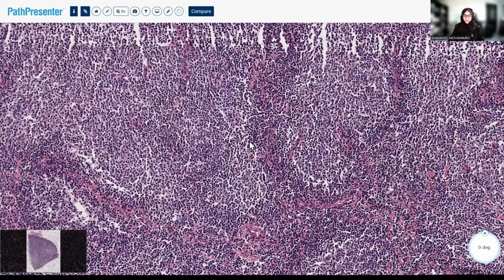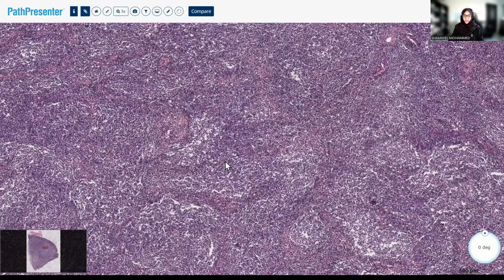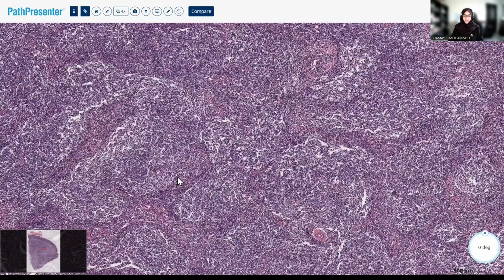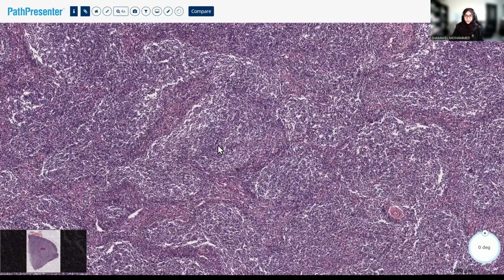One of the issues that we need to consider here is whether these nodular or round or follicular structures that we see are normal germinal centers or are they atypical proliferation, atypical follicles, or neoplastic follicles? If we compare it to the germinal centers that I showed you in our lymph node histology episode, they certainly don't have a reactive germinal center in the middle. They don't have a mantle. There's no polarization. And all you can see is this nodularity or a proliferation of a follicular pattern.